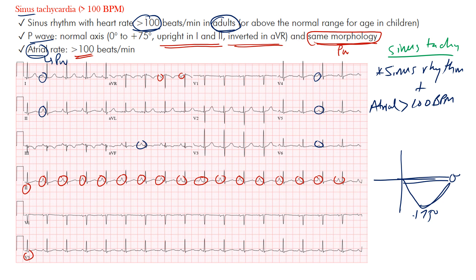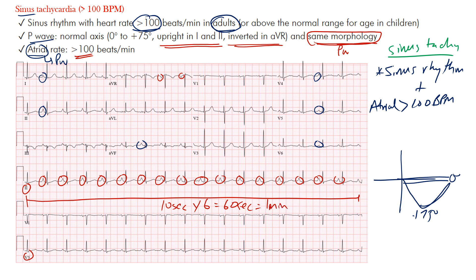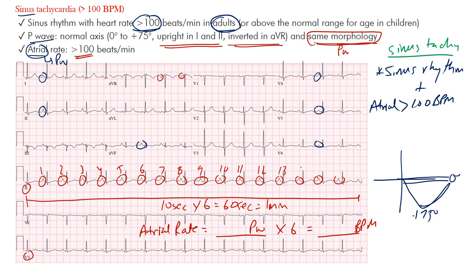Let's work to find the rate. A standard 12-lead ECG is a 10-second strip; multiply by six to get 60 seconds, which equals one minute. To find the atrial rate, count the number of P waves and multiply by six to get an estimate in beats per minute. This works for both regular and irregular rhythms. So let's count: one, two, three, four, five, six, seven, eight, nine, ten, eleven, twelve, thirteen, fourteen, fifteen, sixteen, seventeen.